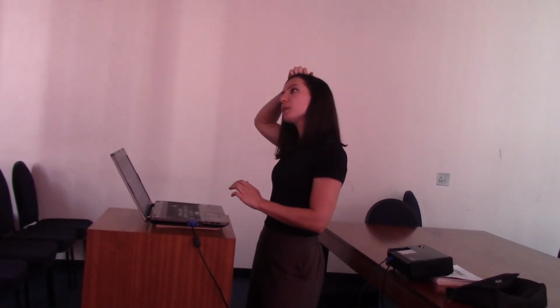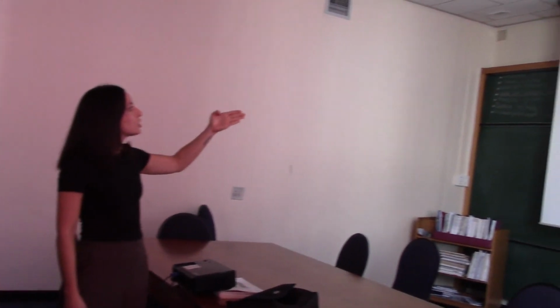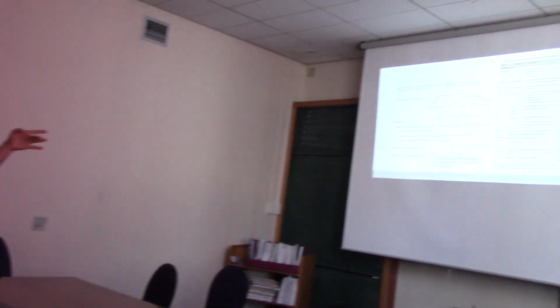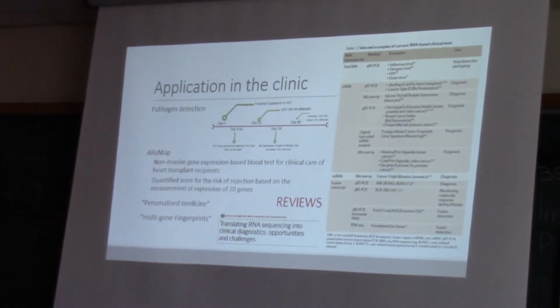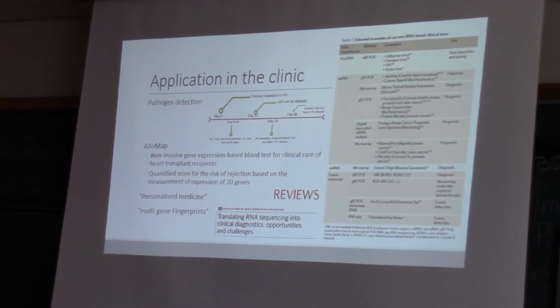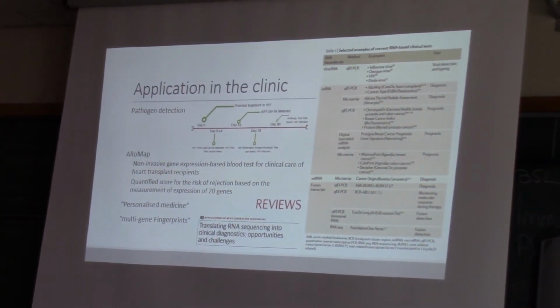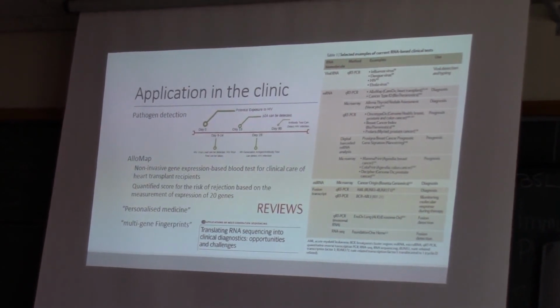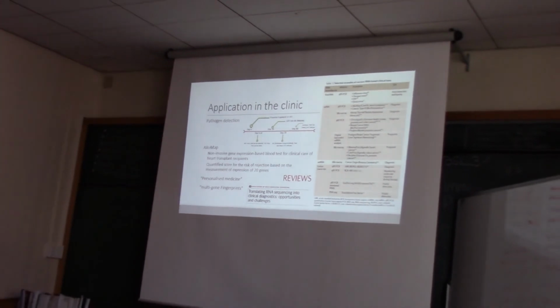In terms of gene expression assays being used in the clinic, it has been very commonplace for a long time. I just wanted to use a few examples. For pathogen detection, qRT-PCR looks at viral RNA from influenza virus, dengue virus, and HIV, which is probably the most common one. You can look at the HIV viral load, the viral RNA of HIV, and identify if someone is infected. Ebola testing is centered around the RNA of the Ebola virus.